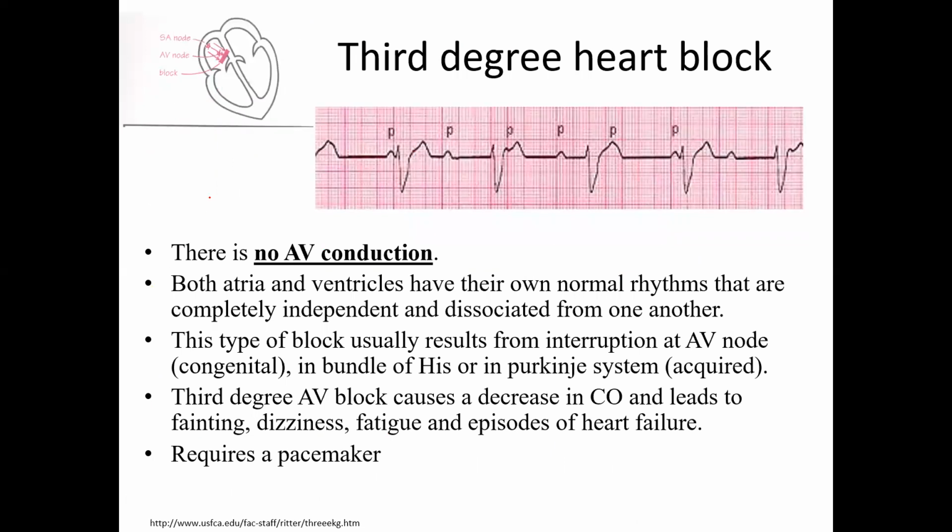So now, just to make this simple, this is 3rd degree AV block, and you'll get some practice EKGs, and you have some for this week too. This one, I think the first thing you look at is, again, you have dropped QRSs, you have a change in the ratio. It's a little bit higher. It's not 1:1, obviously. It's not 4:3. It's definitely in between. The PR interval can be normal or it could be random in this one. And of course, the PR interval is not normal in many of these beats. Sometimes it's really close, like here. So you got to be careful with this one.